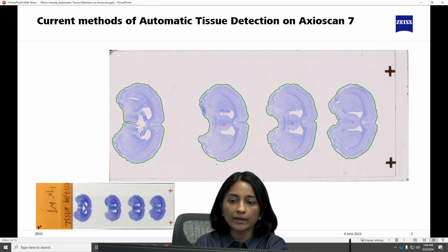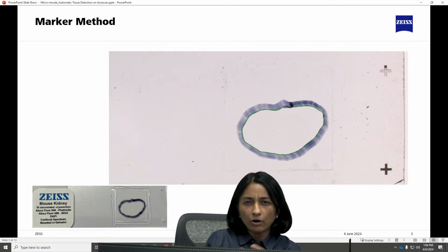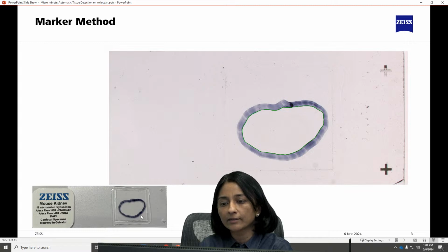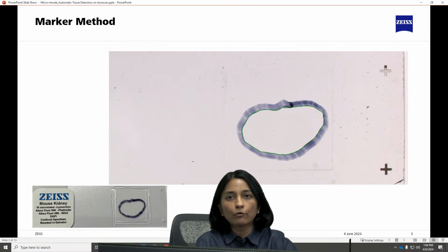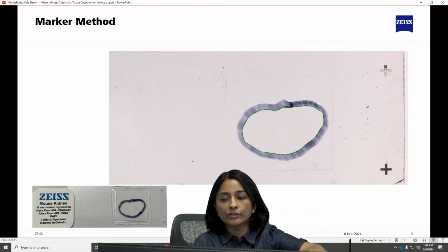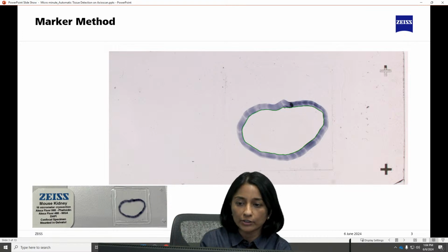Another method would be if you had fluorescent sections, and these are sections that are not as bright. If you look at my slide down below on the screen, these are not easy to see. If you hold them against light, you might be able to faintly see the sections, but not as bright as the stained histological slides.